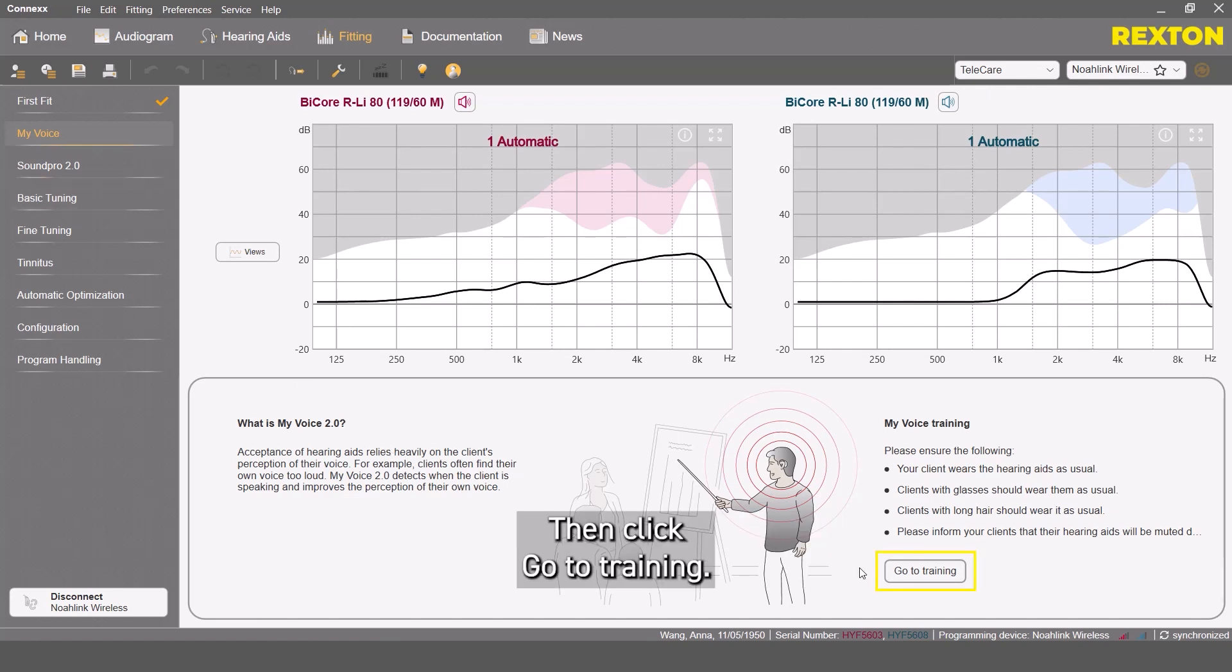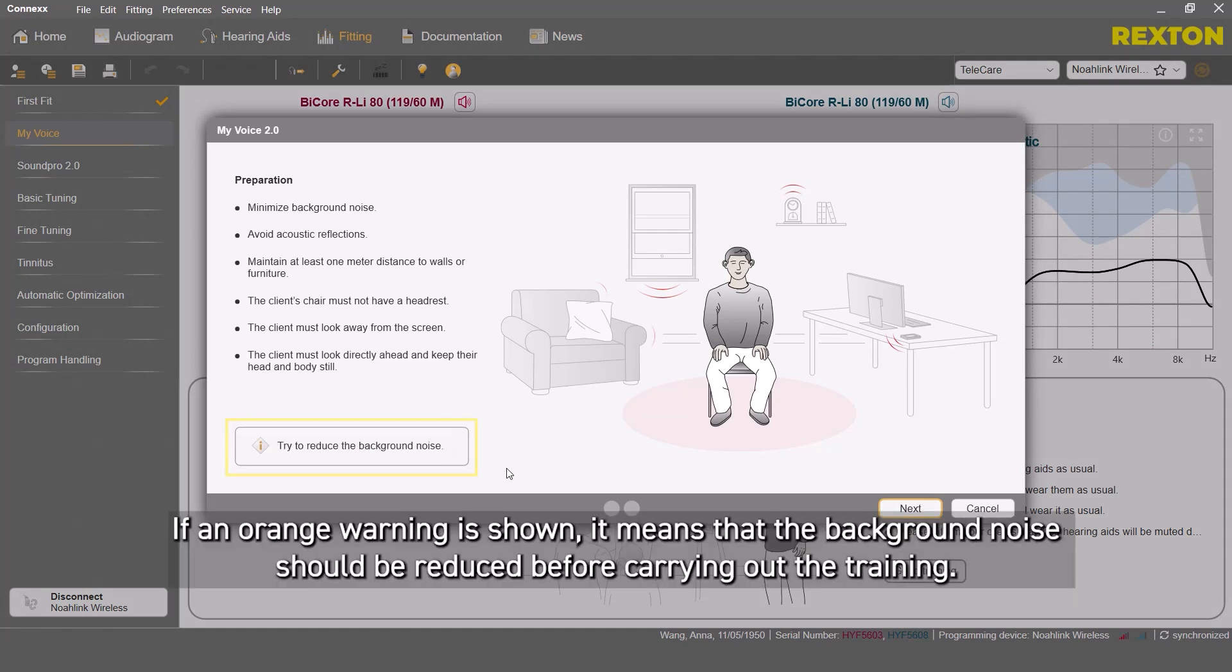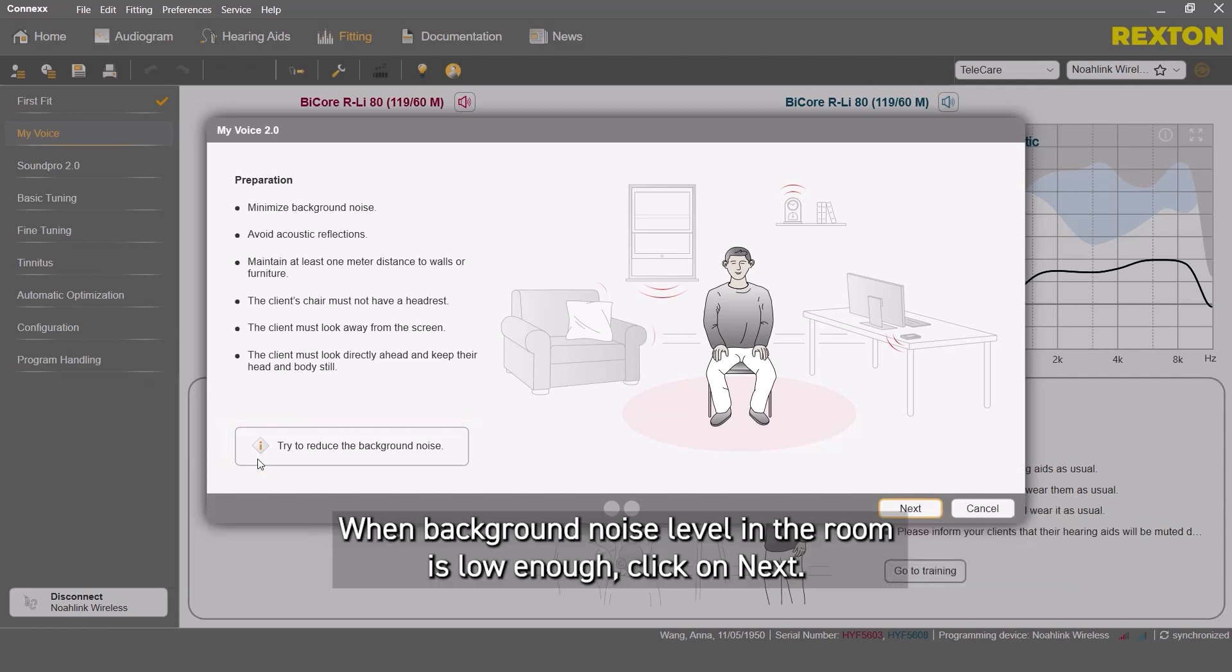Then, click Go to Training. If an orange warning is shown, it means that the background noise should be reduced before carrying out the training. When background noise level in the room is low enough, click on Next.